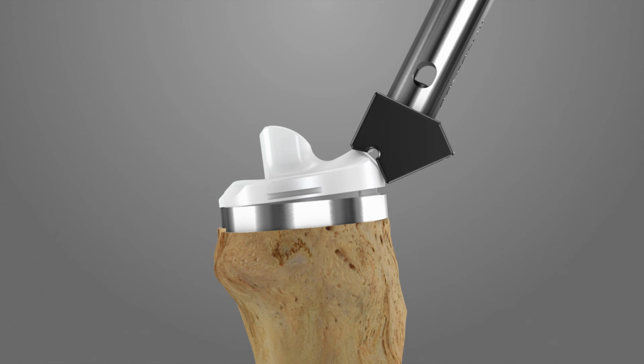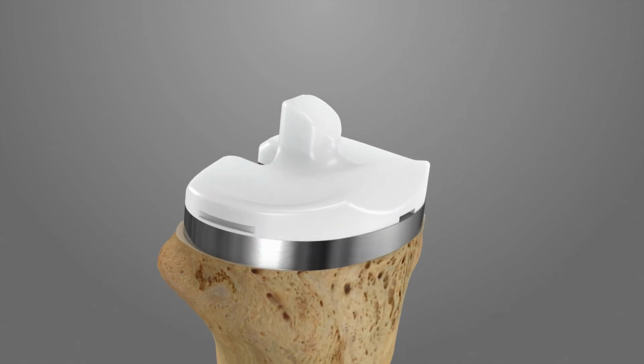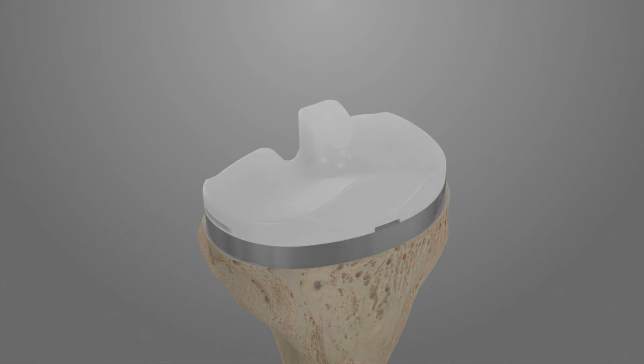Once properly in place, the poly insert will be at a 3 to 5 degree angle to the tibial tray, with no more than a 2 to 3 millimeter gap anteriorly. Ensure the poly insert is fully seated posteriorly within the tibial tray before tapping down, and impact the head of the impactor handle with a mallet. Visually confirm that the poly insert is locked into place within the tibial tray. There should be no gapping between the poly insert and the tibial tray.